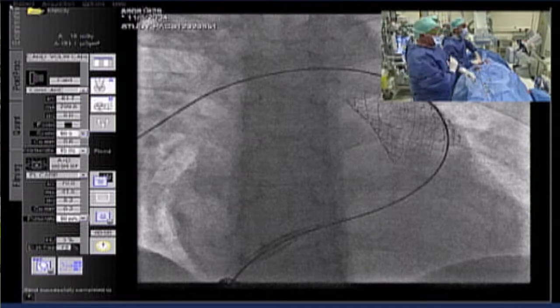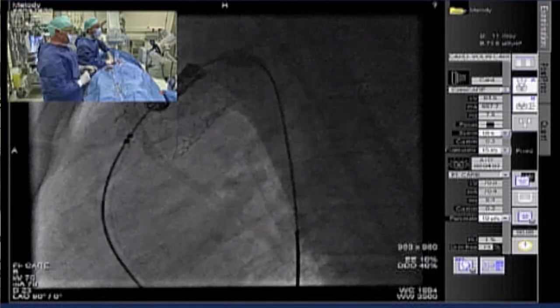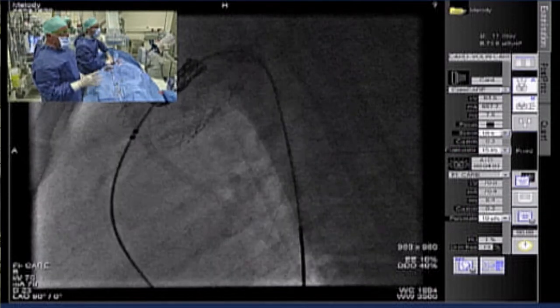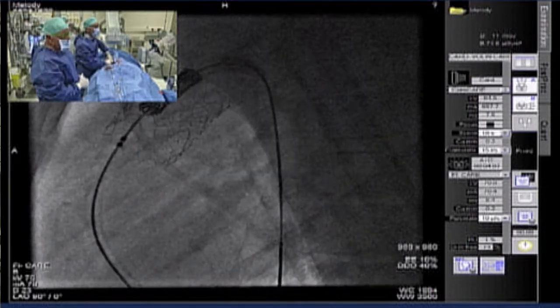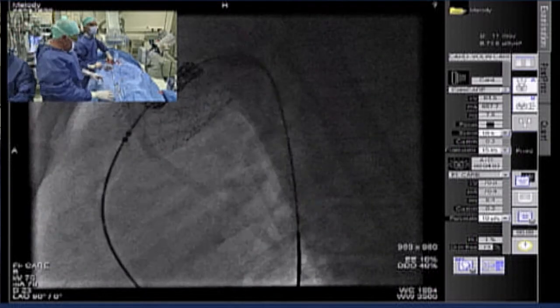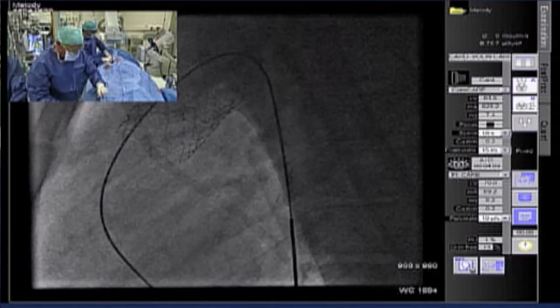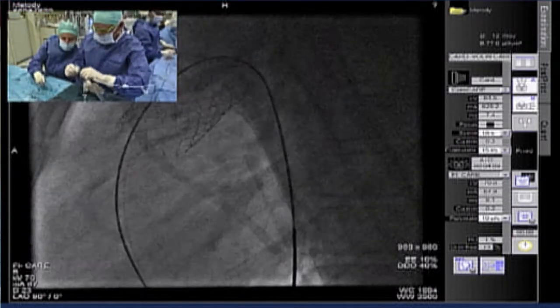Okay, we have a problem that you see now. The advantage of the new ensemble system is that the valve is slightly. But it's okay. He can inflate it. Well, I'm gonna get out and reposition the melody on the balloon. The melody is too distal on the balloon. It's not safe. It may embolize distally. So we come out again with the ensemble, and I just open it a little bit. You want us to go back to San Donato and then come back to you? Okay, perfect.